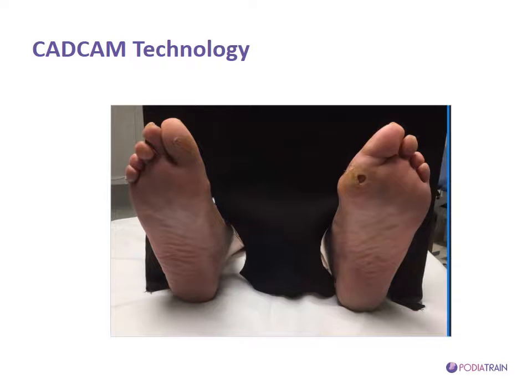So, following the clinical examination, we decided that we will be using a total contact insole in order to offload the neuroischemic ulcer that, as we can see, is situated a few millimeters distal to the first metatarsophalangeal joint. The idea will be to offload this area by the use of a total contact insole, which will cover the area of the arch, and we will be designing a single-winged plantar cover in order to redistribute pressure from the area of the first MPJ to the other metatarsophalangeal joints.